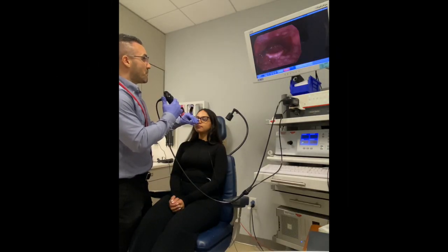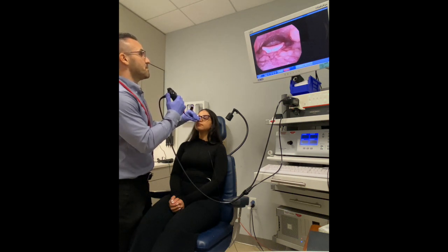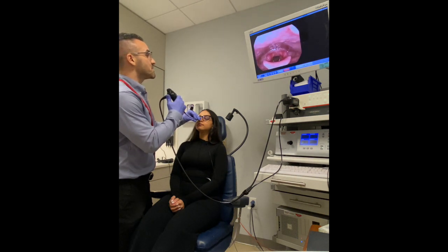Before we get started with the therapy, we're going to do a little mini assessment. I want you to lift your chin up to the ceiling. And hold your breath lightly for three seconds — whatever that means to you. And relax. Do it again. Hold your breath lightly for three seconds. And relax.